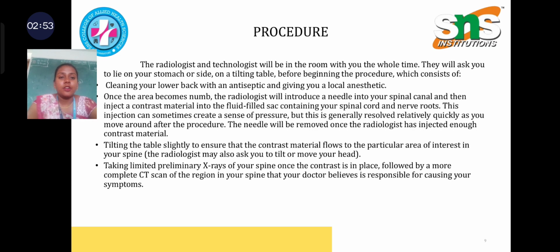Procedure: the radiologist and technologist will be in the room with you the whole time. They will ask you to lie on your stomach or side on a tilting table before beginning the procedure, which consists of cleaning your lower back with an antiseptic and giving you a local anesthetic.